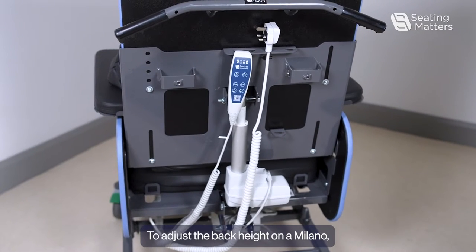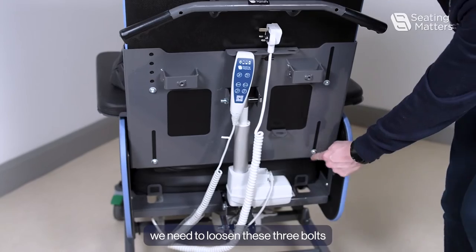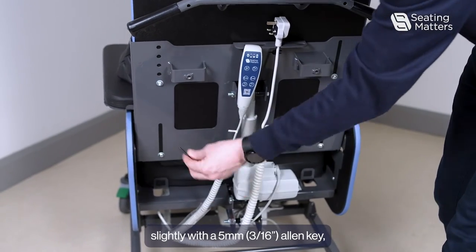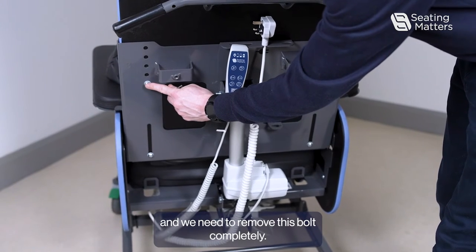To adjust the back height on a Milano, we need to loosen these three bolts slightly with a five millimeter allen key, and we need to remove this bolt completely.